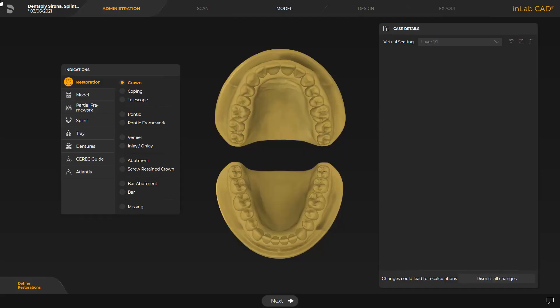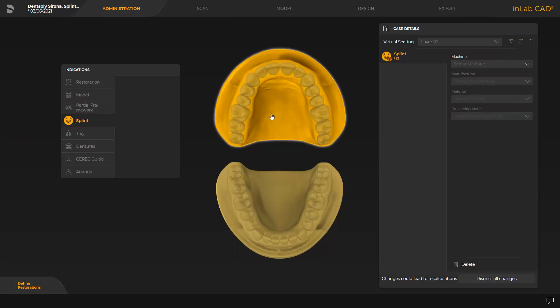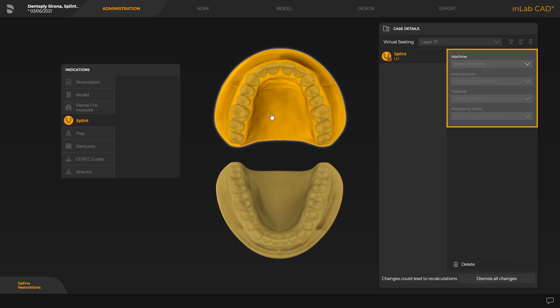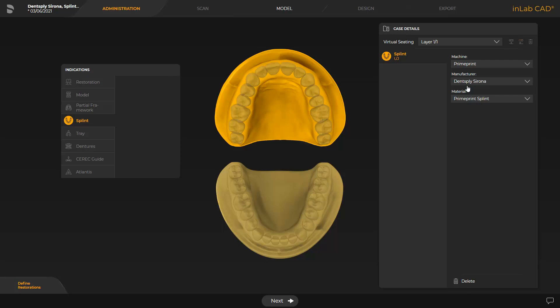We start in the administration phase and tap on the indication splint first. Then we click on the corresponding jaw. Now we select in the window under case details the machine. After all information has been entered, we can move on to the next phase, the scan phase.